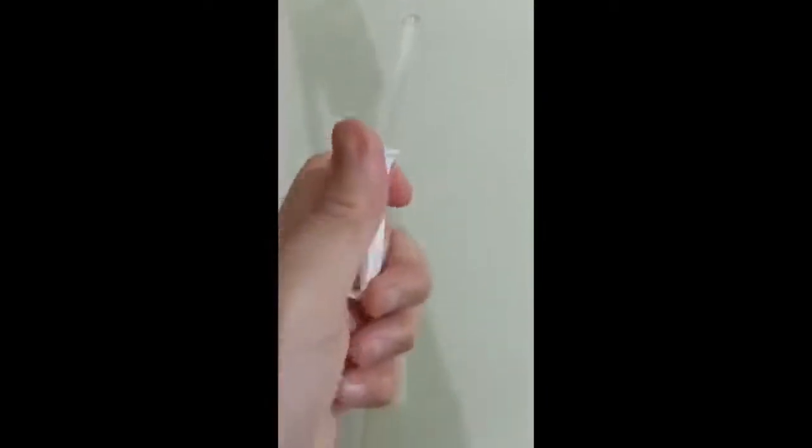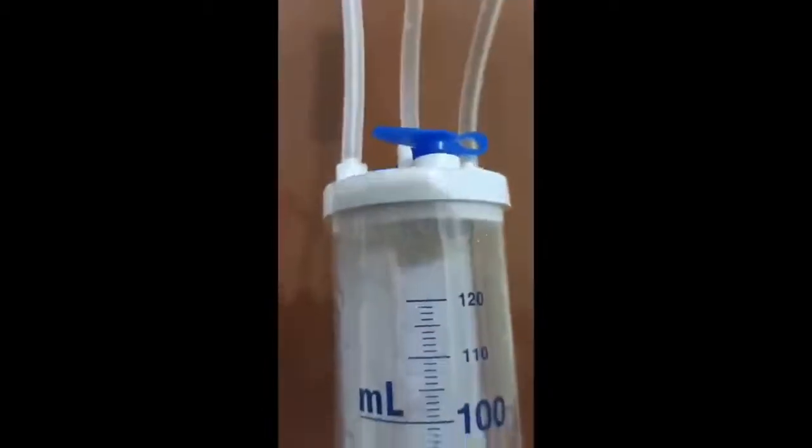Squeeze the drip chamber gently until it is half full of the IV solution. This reduces the risk of air entering the tubing, and if the chamber is completely filled, you cannot observe and properly regulate the drip rate.